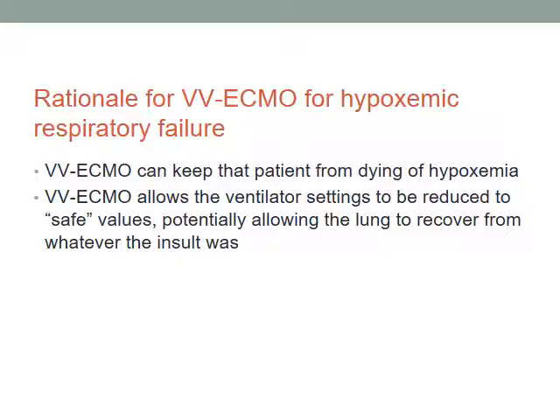So you've got a patient whose lungs have been damaged, and these damaged lungs we then damage further. It's like coming in with a burn and somebody says, I know what to do, put hot water on it. Well, you know, bad idea. But that's what we do with ventilators, we keep the damage going. With ECMO, we can turn the ventilator down, turn the FiO2 down, turn the pressures down, and hopefully stop the ongoing damage and let the lungs heal.